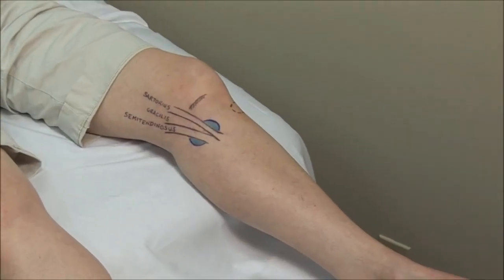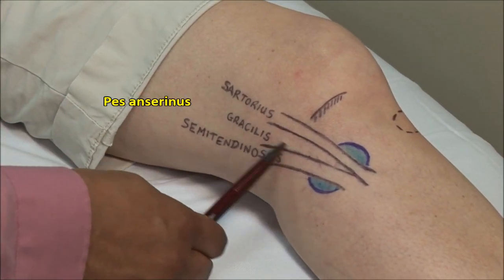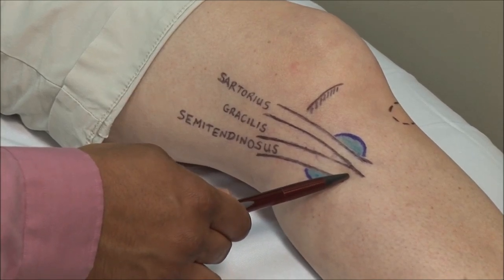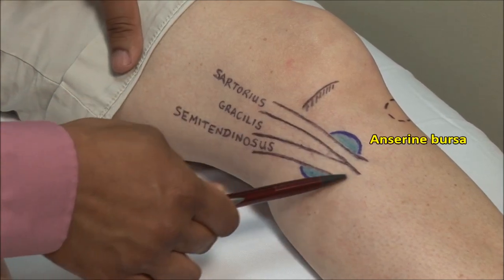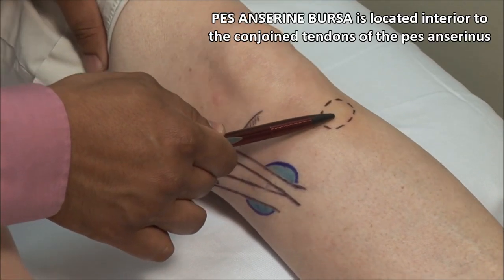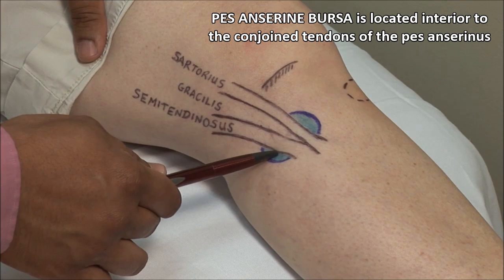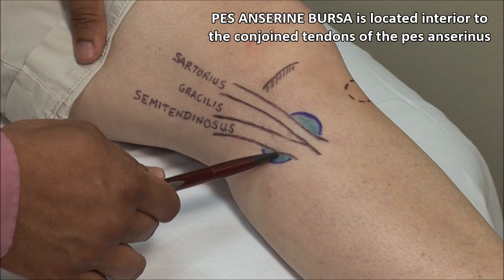The PES anserineus refers to the conjoined tendons of the sartorius, gracilis, and semitendinosus muscles. These attach to the anteromedial aspect of the tibia, inferior to the joint line. The anserine bursa is located interior to these tendons at the level of the tibial tuberosity. Explaining the location to patients and pointing out that it is away from the joint line and the joint itself helps them understand the diagnosis and the cause of their knee pain.